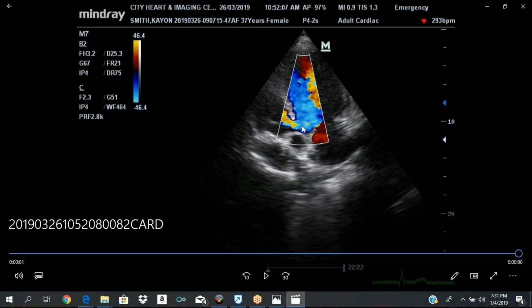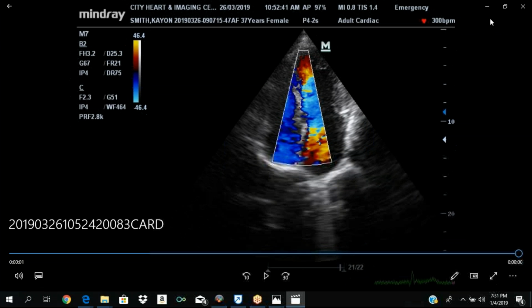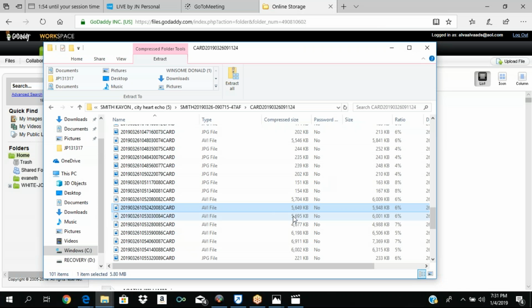Let's open it up, and then you have one pulmonary vein right there, another over that side. So you want to pull it down towards the feet. Remember, these movements are very minuscule. These are very fine movements. Okay, so it's nothing drastic.